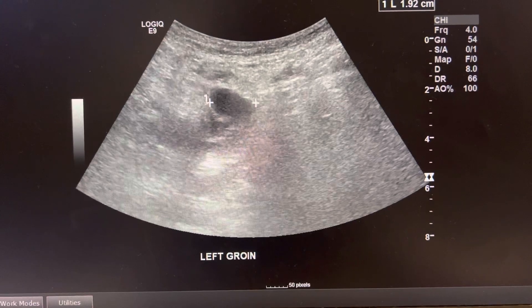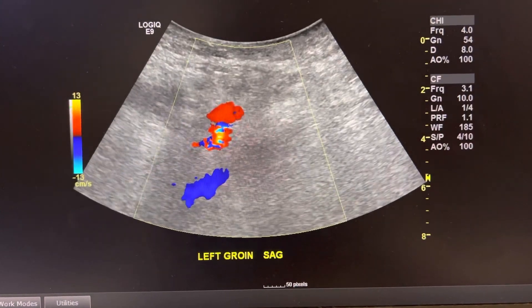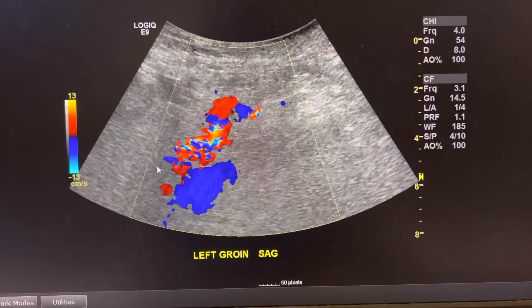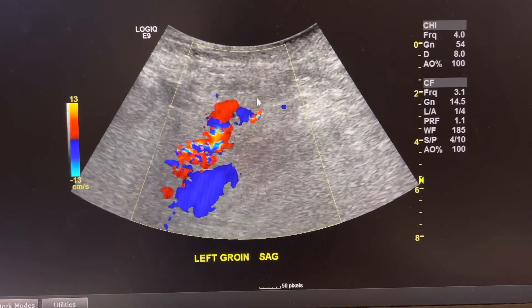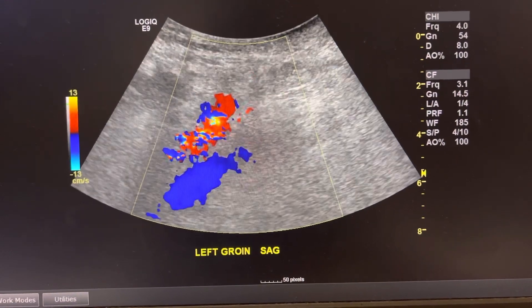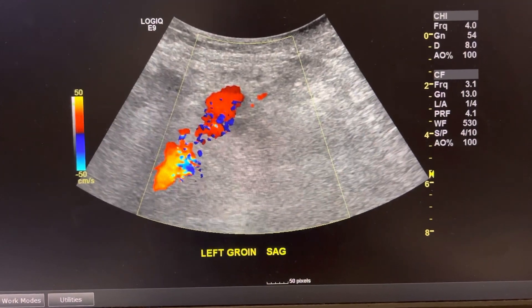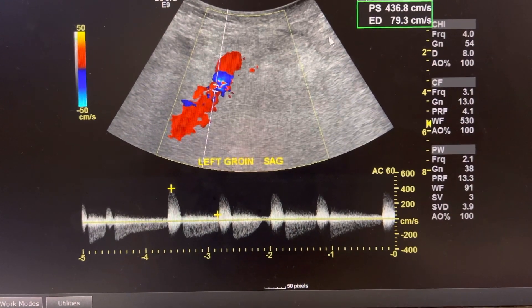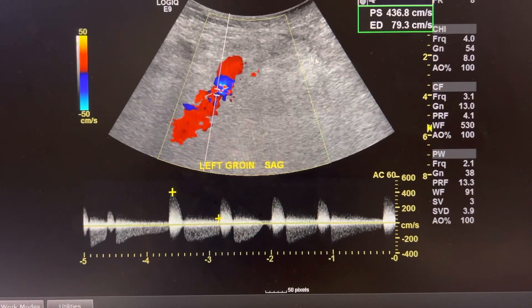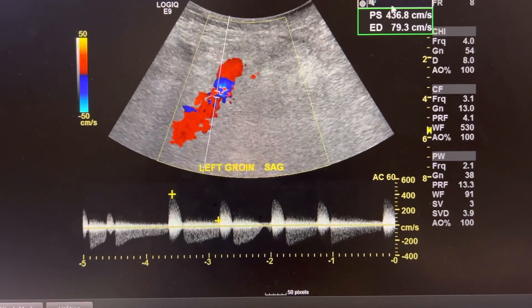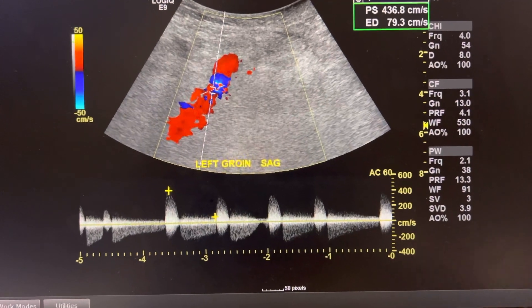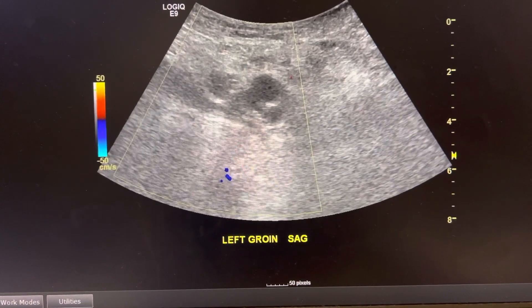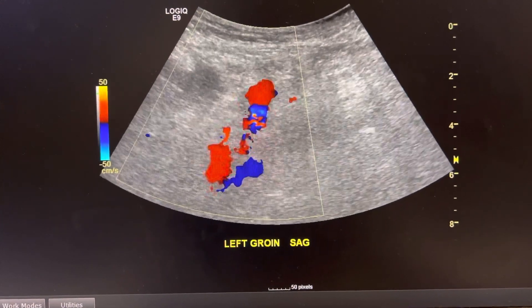I measured the pseudoaneurysm and took a picture of it in sagittal. This is the common femoral artery here connecting to the pseudoaneurysm. It's really hard because the patient is in a lot of pain and is super swollen, but you can see that the velocities are really high and elevated. Here's another live cine in sag.